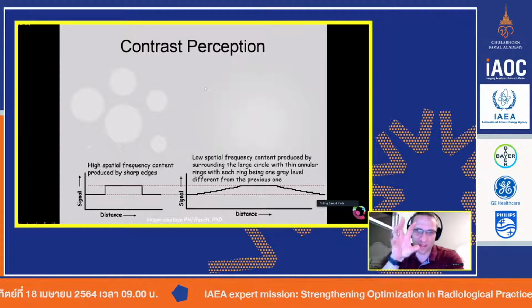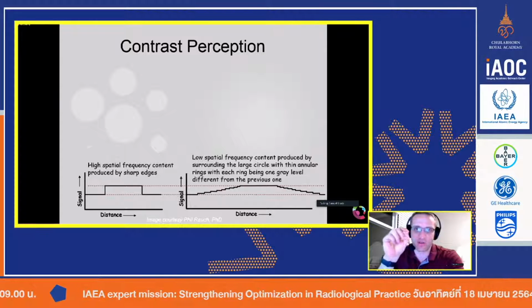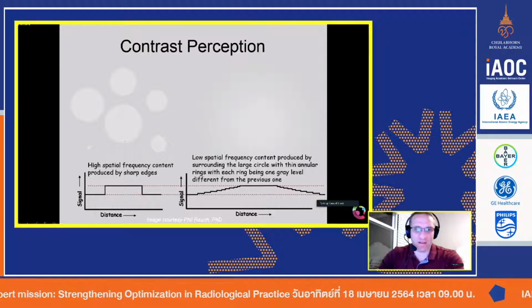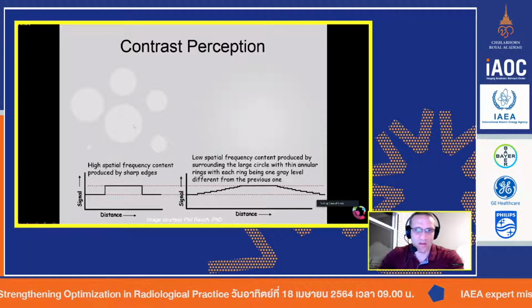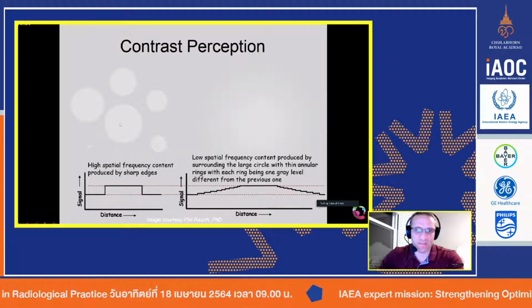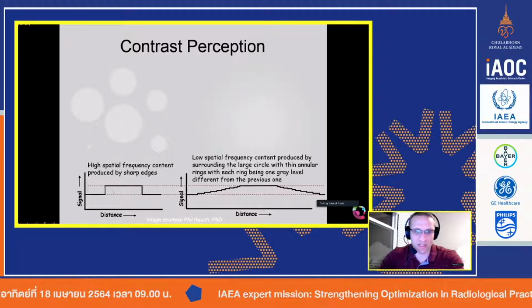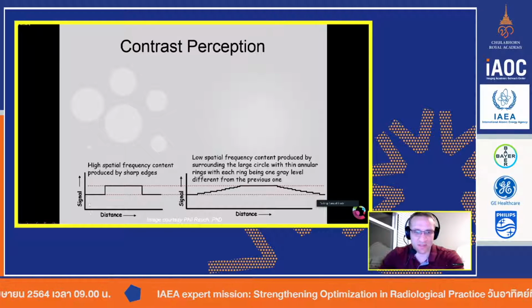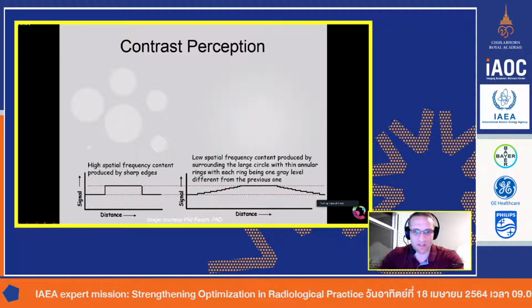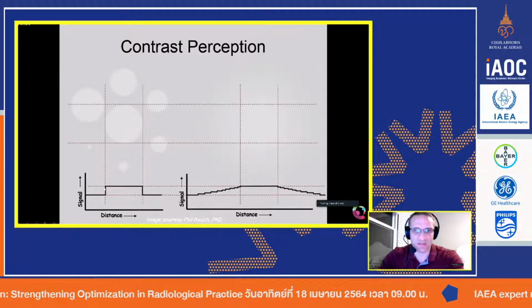Let's give an example of how edges can show contrast. On the left-hand side, I have a variety of circles, but the circle itself is a lighter or brighter grayscale than the background. And here, using a nice plot, you can see that the background and the object itself are two very distinct grayscale levels.